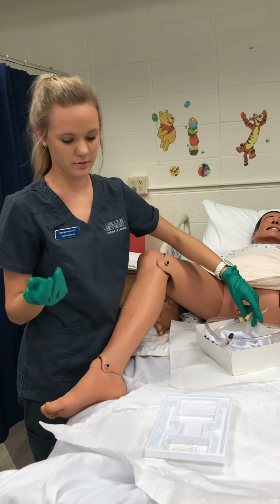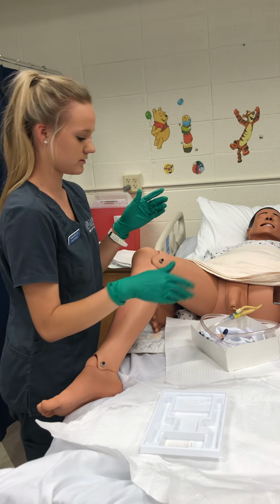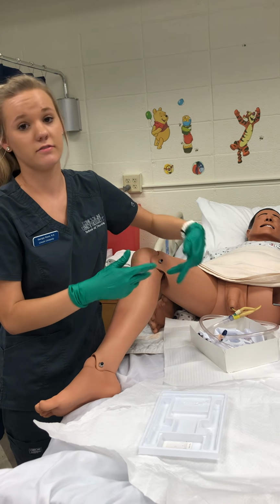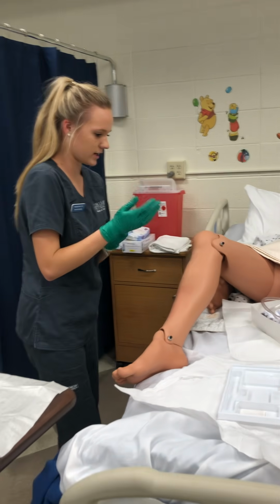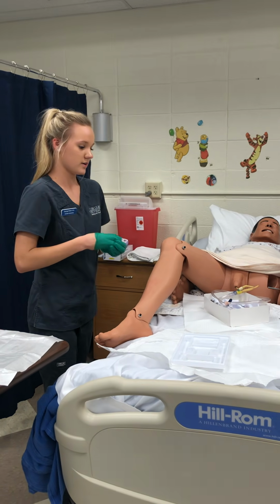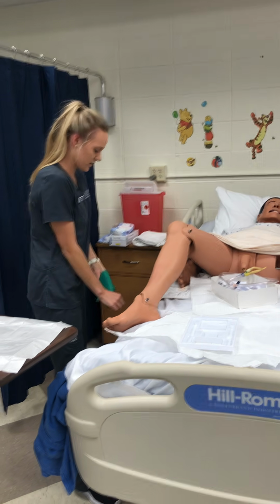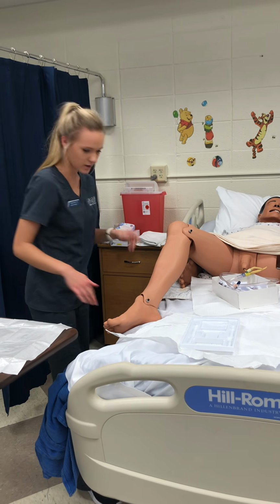Okay, so now I no longer have to be sterile. I'm going to go ahead and assess. I would want to assess the amount and color of the urine that comes out, but I'm going to go ahead and clean up my patient because those cotton swabs would usually be betadine, but for the purpose of our mannequins in this video, I used cotton swabs.